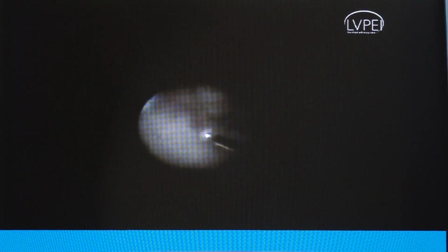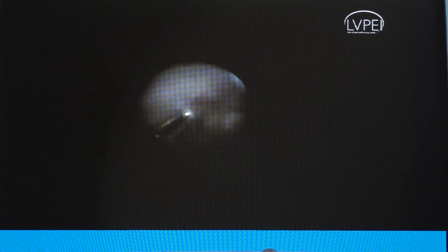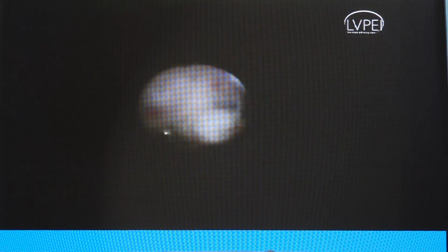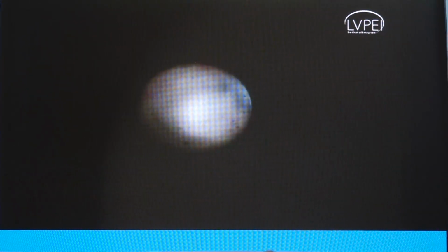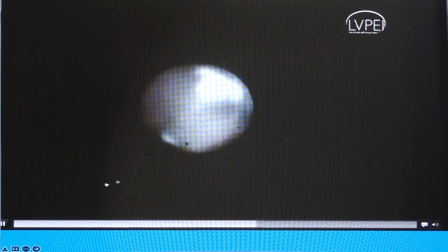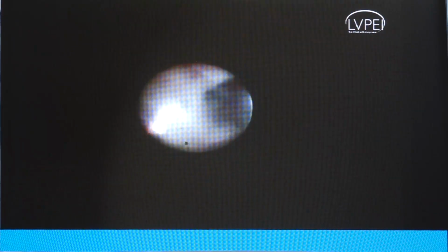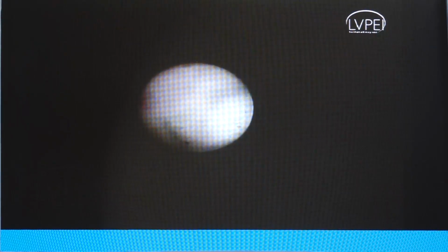Subsequently, we did a vitrectomy and ended up putting oil inside the eye. And at the end of the surgery, we were able to achieve at least an ambulatory vision. This patient from PL plus now has a vision of counting fingers at 2 meters in a silicone oil filled globe. But for a patient who had actually no vision, counting fingers at 2 meters can be a bit of a blessing. So this approach allowed us to go inside, assess the ciliary body membranes, and try to remove as much of them as possible, which otherwise with a conventional system would have been more difficult.